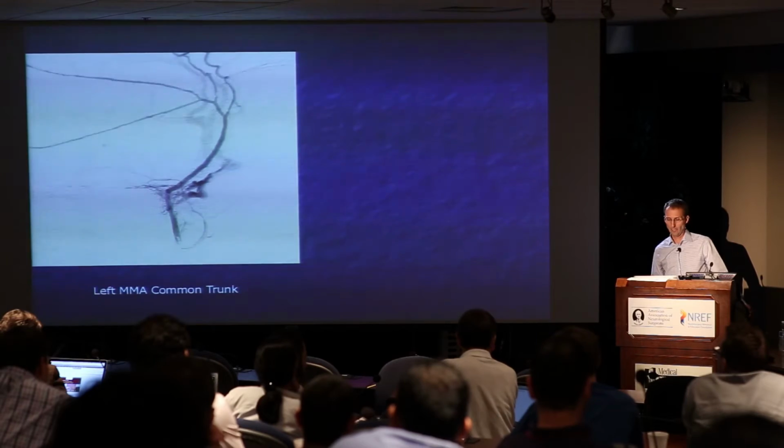One thing on this one picture, in my experience, you can't possibly tell exactly where the fistula comes in. It depends on where the other suppliers are coming in. Sometimes you can see a pool, maybe a big common arterial trunk that leads to the fistula and gets many arterial supplies. So you have to look at multiple projections, multiple vessel runs, to figure out what is the last point where others enter and identify the fistula correctly. It can be very, very tricky. Yeah, I completely agree with that.